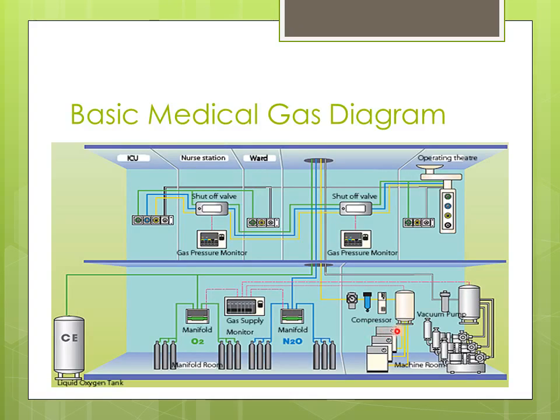Over to all the way to the right, you've got your compressors and your vacuum pumps and your tanks. And this here could be maybe some dehumidification for your medical air and monitoring as well. And over here, of course, on the other side is your vacuum system. And you see again, here's your gray line going up and probably up to the OR. And down here is your yellow, which is your medical air, and it's going up and out and being distributed.